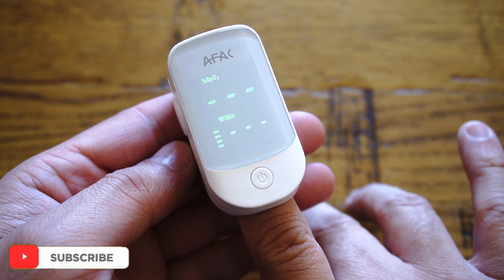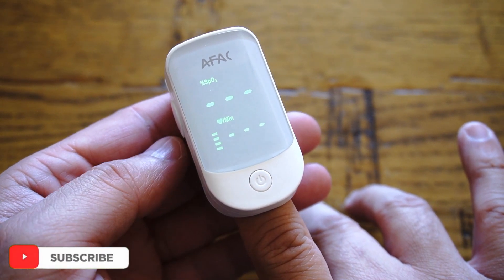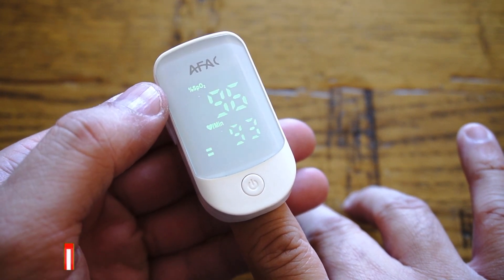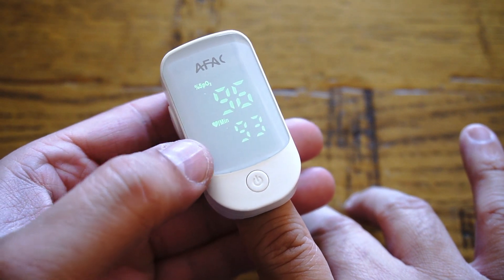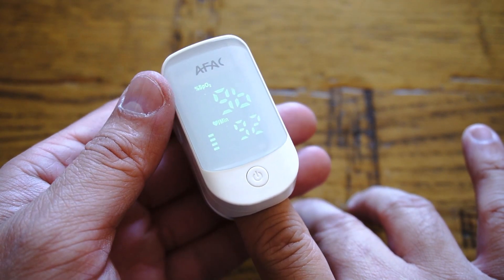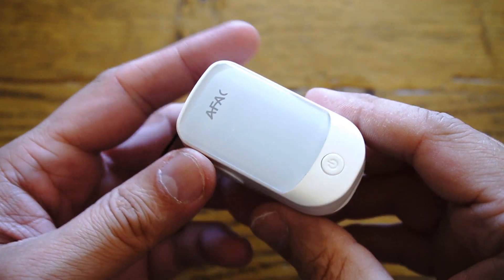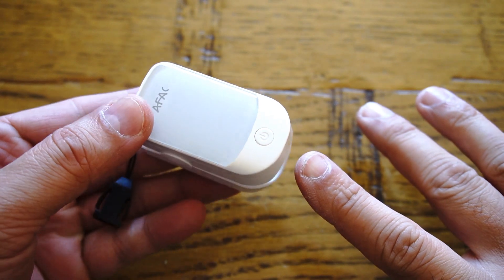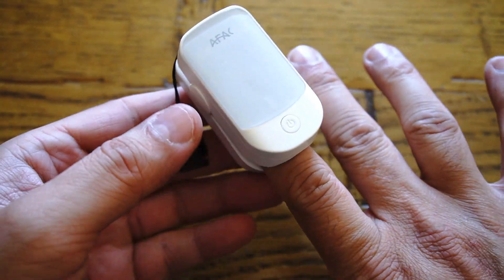If you go ahead and search for a pulse oximeter, you're going to find hundreds of them, but the one I'm reviewing in this video is by AFAC. The reason I purchased this one is because it's accurate and FDA approved, also comes with CE and RoHS approval, and the best thing is it's fast to measure and easy to use.